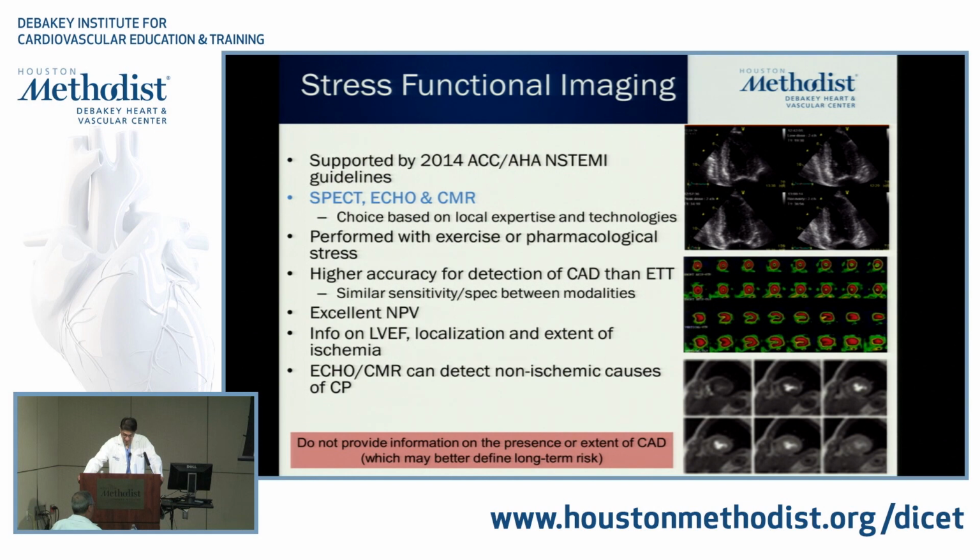You also, with some of these tests, get information about ejection fraction. You can localize where the ischemia is, and you can tell how much ischemia the heart has. And some studies, like echo and CMR, can actually detect non-ischemic causes.